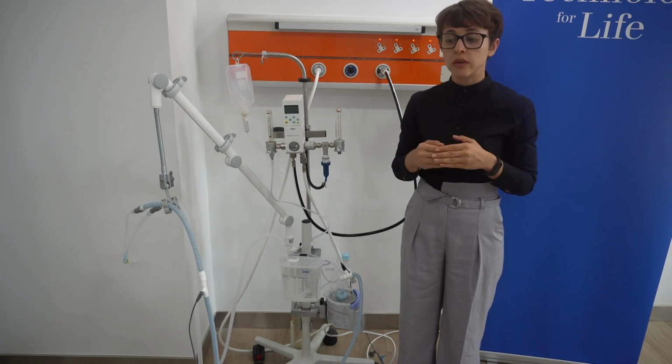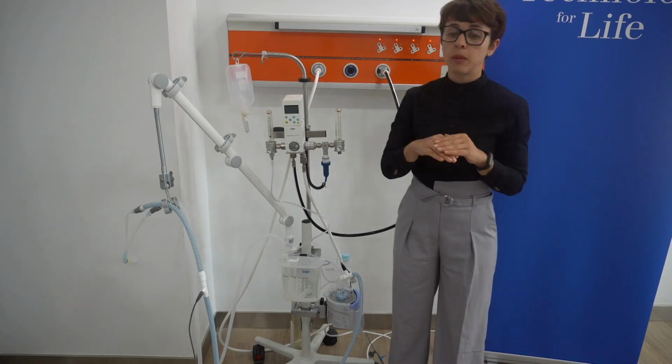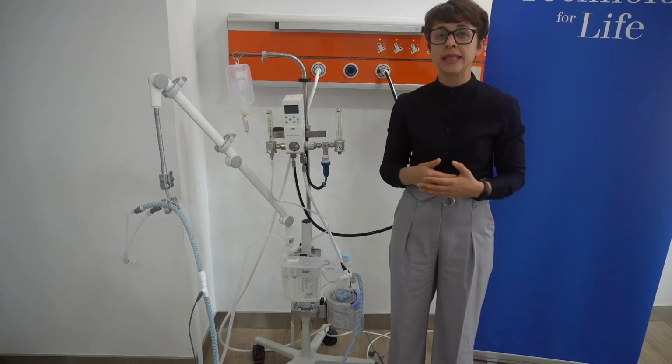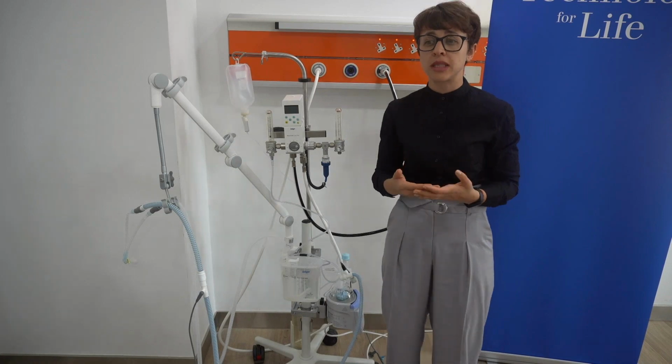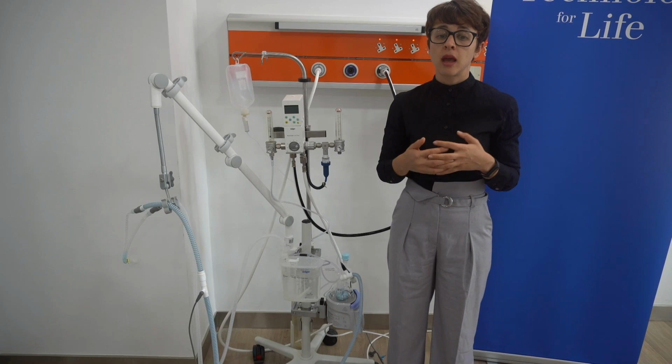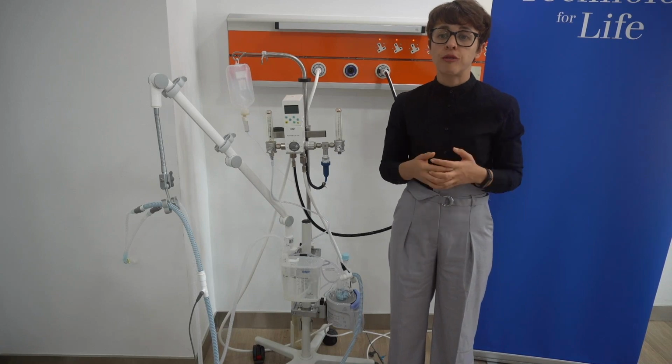So the idea behind it is that we provide stable pressure to maintain the functional residual capacity of the babies and also prevent atelectasis or alveolar collapse on expiration.